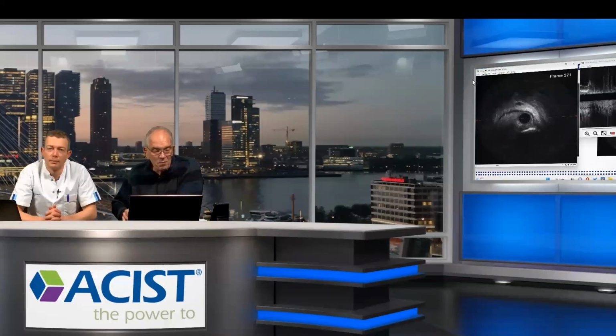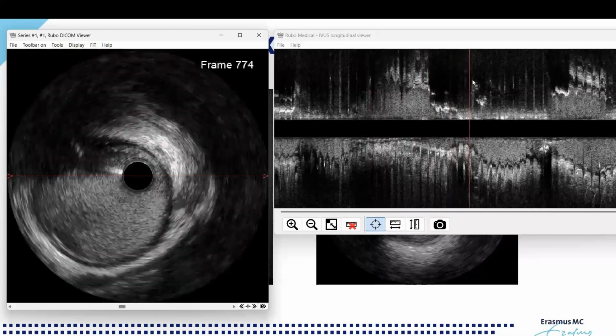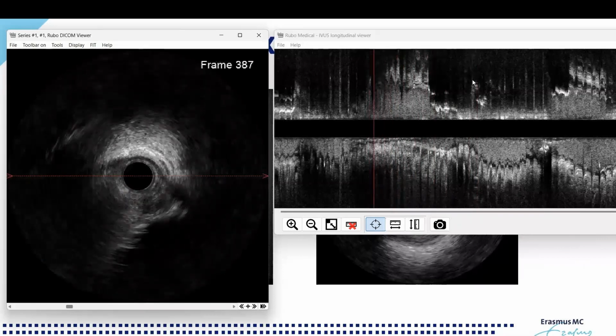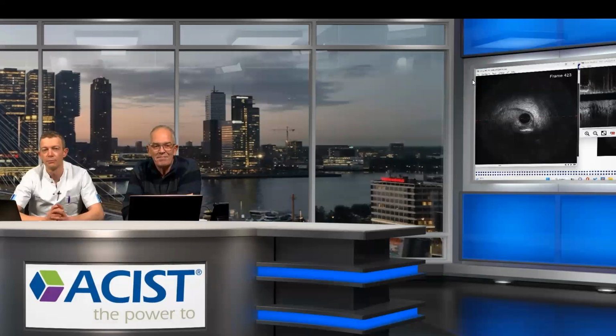So this is interesting, and when in doubt, irrespective of the cases I do, if I do physiology and I don't get what I measure, I use imaging, and that really helps you to better appreciate the disease severity. Obviously, knowing that if you use imaging, there's a 20% higher likelihood that you will put in stents compared to physiology. But in case you don't understand it, I think the imaging really helps you to better appreciate what you're looking at. Yeah, because imaging is part of your instrument also, like physiology.